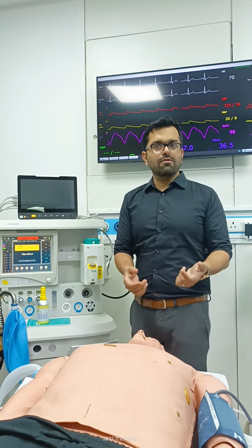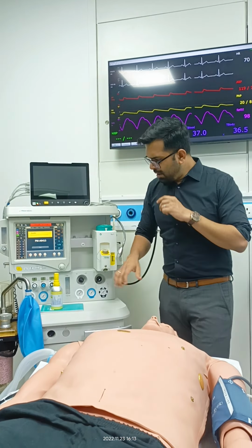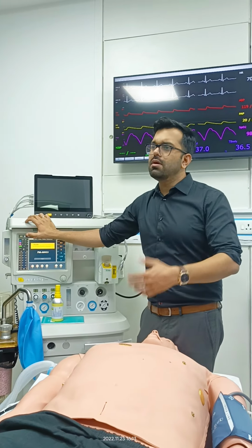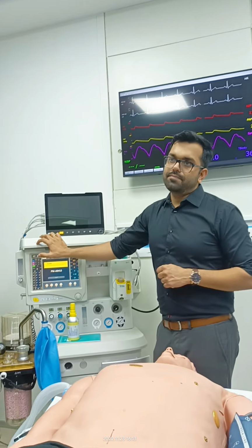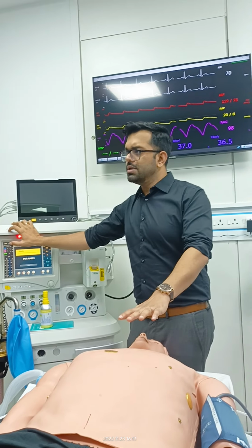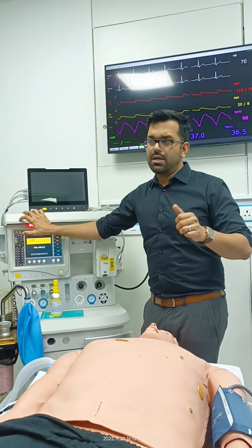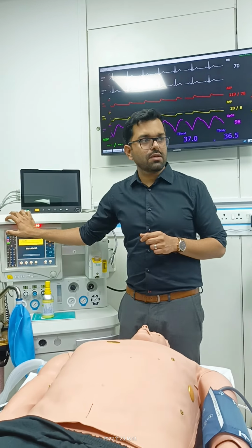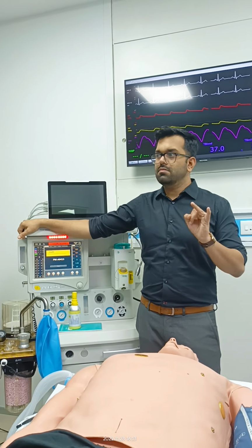The first response that you get to see, sometimes the patient opens their eyes, you will see spontaneous breathing, and depending upon that, you can switch off the ventilator and let them breathe spontaneously. Once the patient is completely awake, you take out the tube. We don't extubate the patient unless the patient is awake, breathing spontaneously, and reflexes are present. Once you're absolutely satisfied that you don't have to intubate the patient again, take out the tube, and the surgery is done. This is how it goes. So induction, maintenance, and reversal.